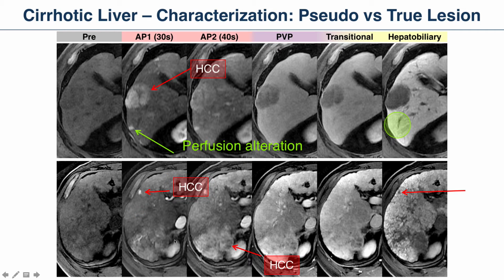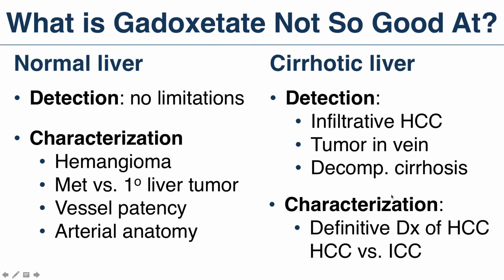And so that potentially makes a difference, because if you are going to be a surgeon and you want to resect, you'd have to resect this as well as this. Now, none of us are surgeons, right? But some of us are interested in interventional radiology. And so those of us who want to do interventional would either want to treat this while you're treating this, or at least be aware of this. So even if you decide not to treat it, at least be aware of it and follow it closely.